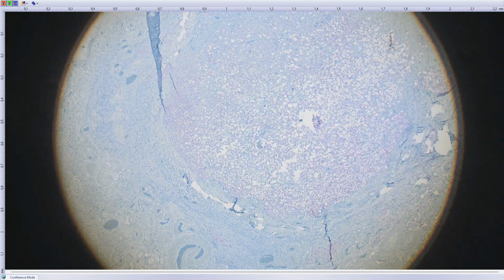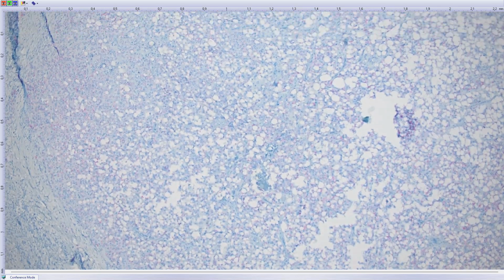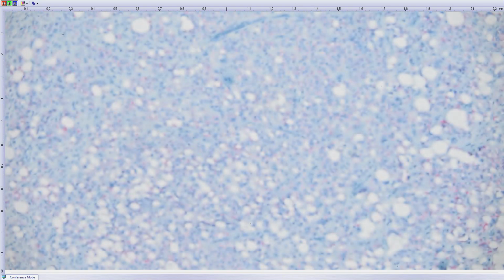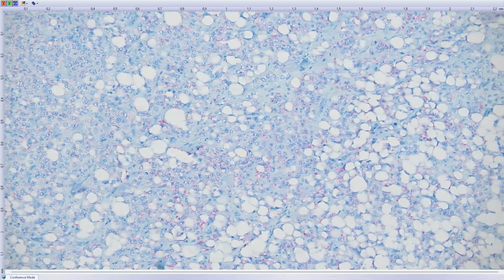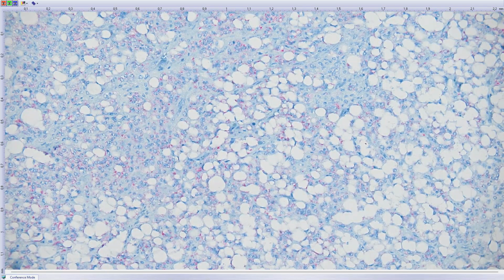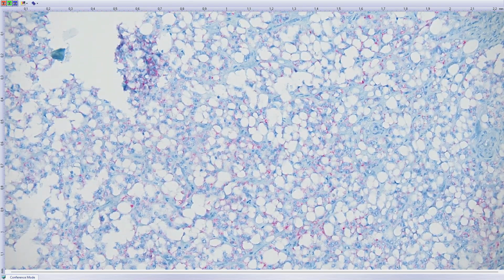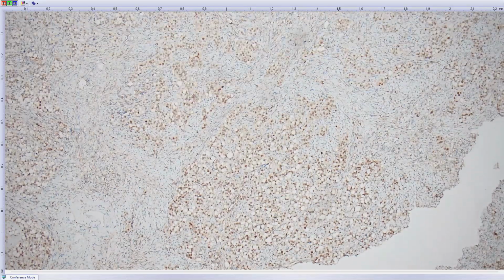And now this is immunostaining with antibody ABCD1. And you see it is granular positivity inside of cytoplasm, because this antibody stains peroxisomes, which have cytoplasmic structure. And the same, we found positivity for SF1. You see nuclear staining.